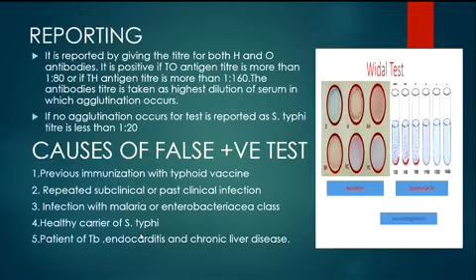As you can see here, these show some agglutinations. This circle shows some agglutination, this circle also shows some agglutination. So this is supposed to be the titer, as this is the highest dilution with agglutination, while again you can see that there is less agglutination here. So this can be the highest titer.